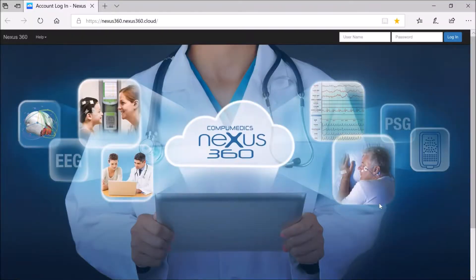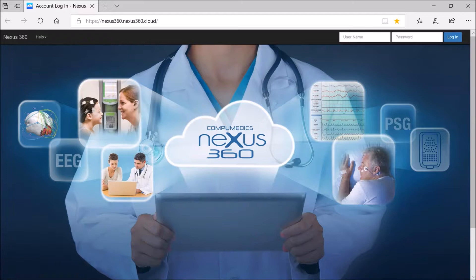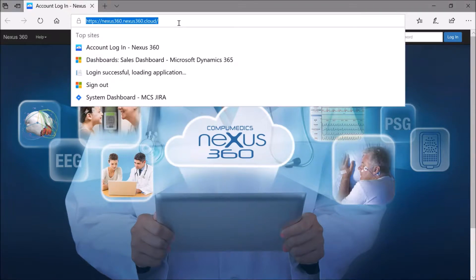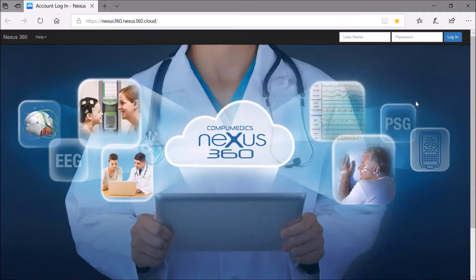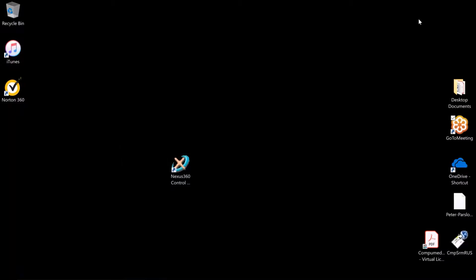Welcome to today's tutorial. What we're going to go through is acquiring a study in PSG online, then going into Nexus 360 via the web browser interface and opening that study in Profusion PSG whilst it's actually acquiring. We've got our Nexus 360 instance here in the web browser. First, we're going to set up Profusion PSG online to record some data.